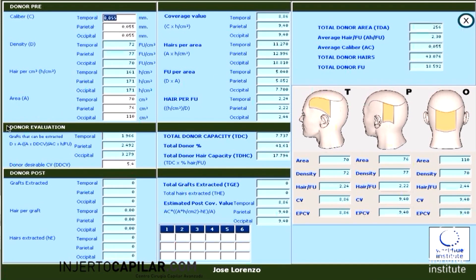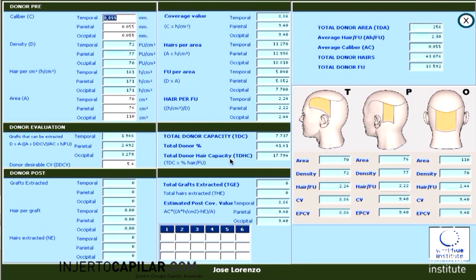In the donor evaluation compartment, if we want to lower the donor capacity to a 5.4 coverage value — which we know is the minimum value to cover the skin — we will have information about the grafts that can be extracted from the temporal, parietal, and occipital areas, as well as the total donor capacity, total donor percentage, and total donor hairs that can be extracted from that single patient in his entire life. But if you want, you can change the donor residual coverage value to six or seven and the numbers will change accordingly.